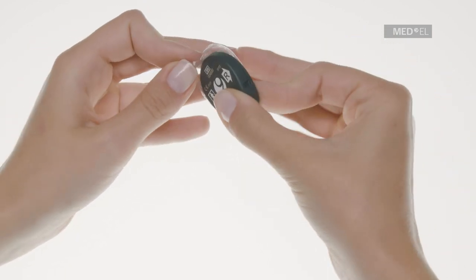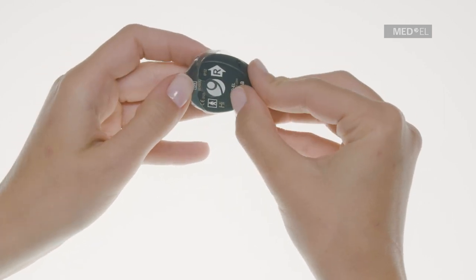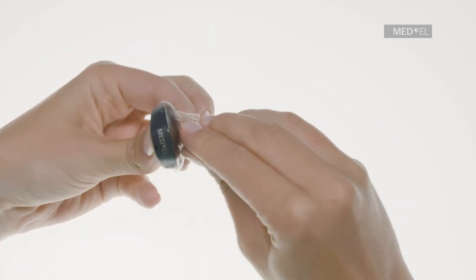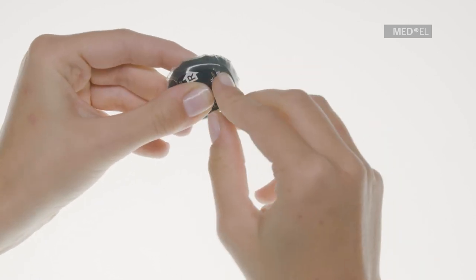Now start inserting Samba into the skin of Waterwear by placing the side opposite the battery compartment into the pocket with the circular flap. Hold Samba between two fingers and grab the rectangular shaped flap with your other hand.